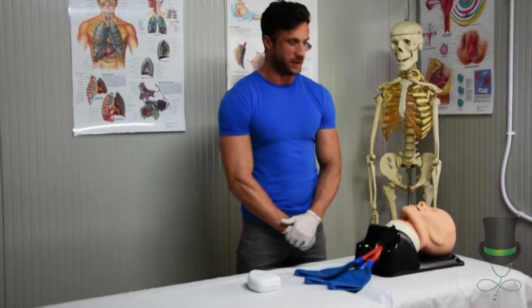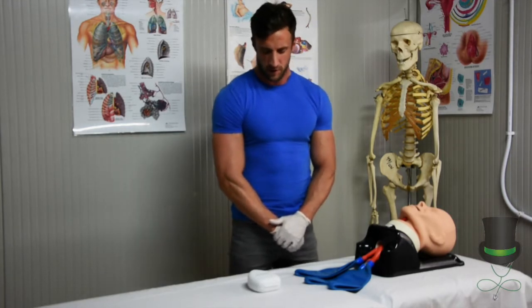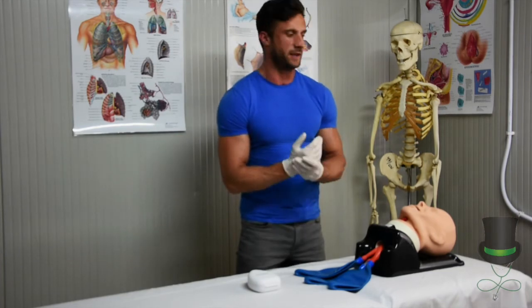Hello, I'm Frank and today I'm going to demonstrate how to use the pocket face mask. Before handling any medical equipment, always ensure you have your gloves on or sanitise your hands thoroughly.